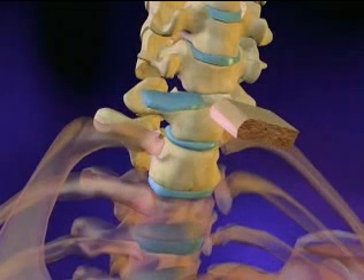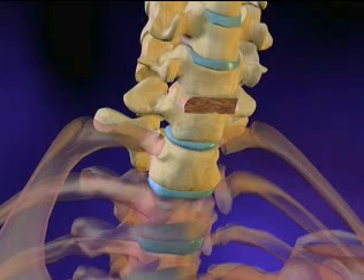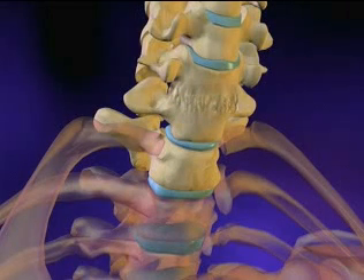Until the bones fuse together, the spinal column must be kept immobile. Oftentimes a metal rod is inserted to keep the spine in place. An external cast or brace can also be used for additional support.